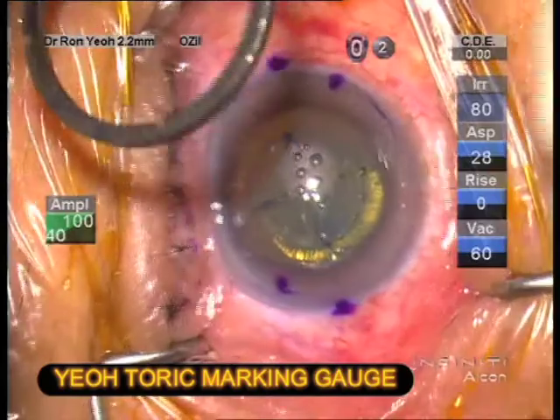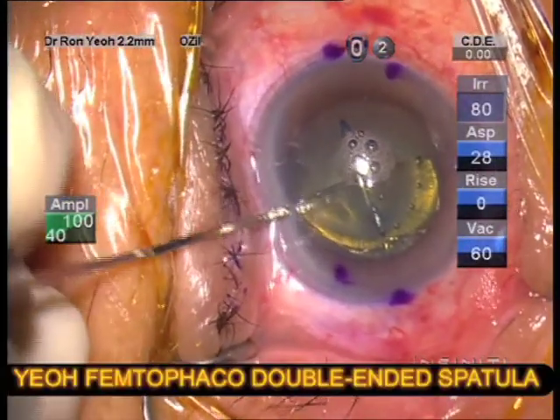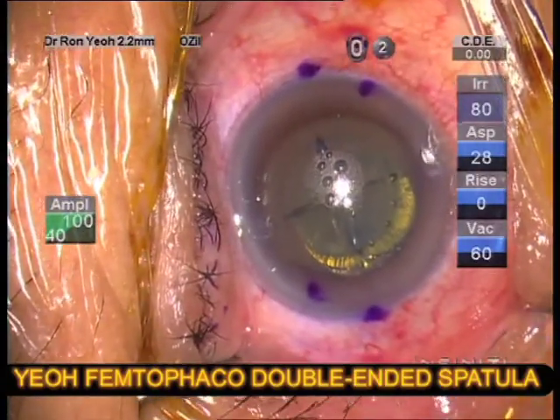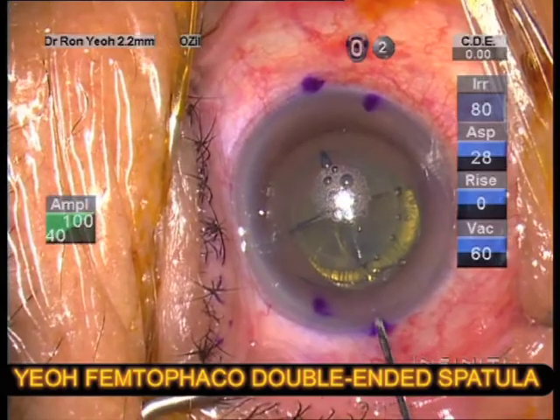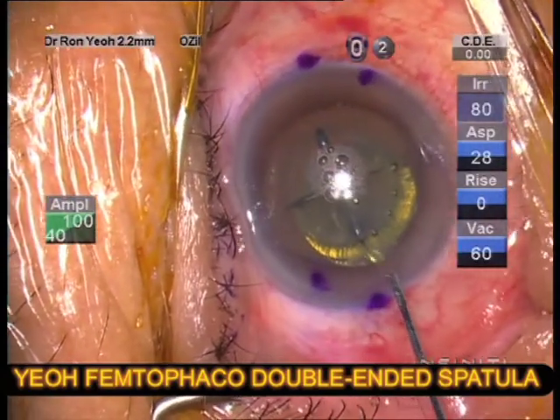The double-ended femto incision spatula is optimized for side port entry at one end and main port entry at the other. It is important to depress down and slightly forward and wiggle the tip from side to side to effect entry.